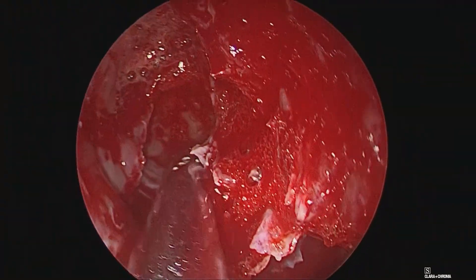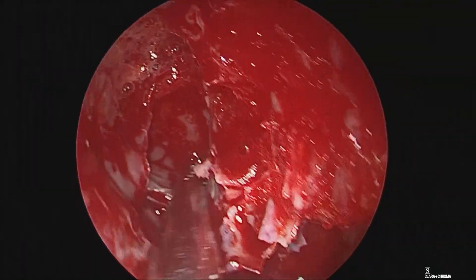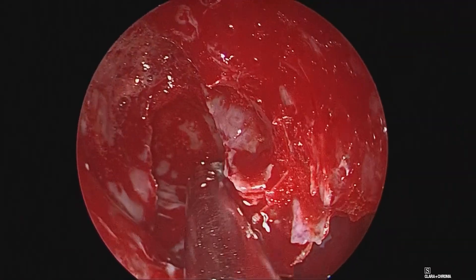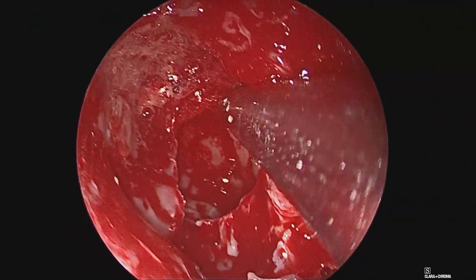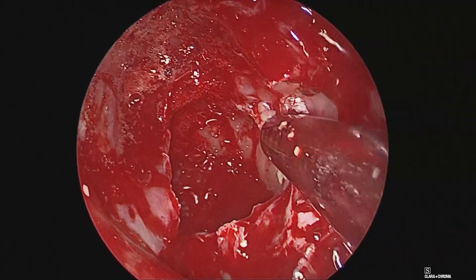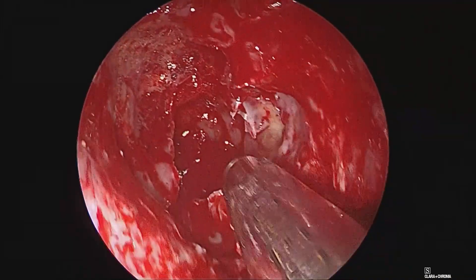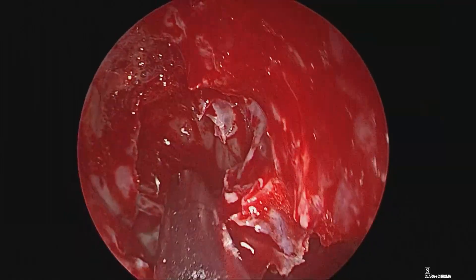These situations are always more oozy and bloody because of widespread inflammation and occlusion of ostia. Whenever we are removing polyps and fungus, they obviously bleed until most of the disease has been clearly removed. Gentle pressure on the lateral wall continues to yield more of this crab-like fungal debris — every bit of fungal antigen must be removed to successfully complete this surgery.